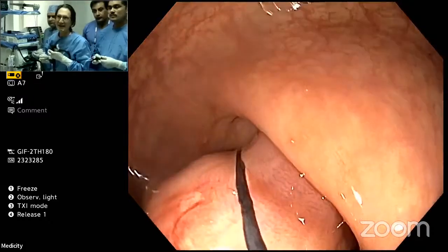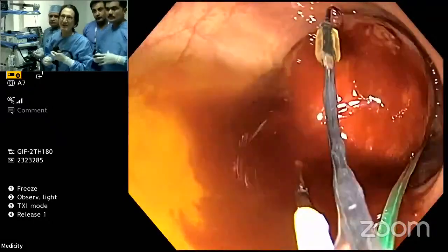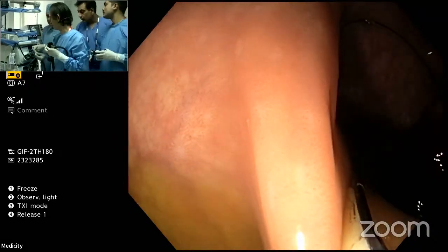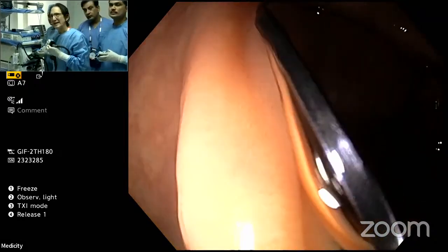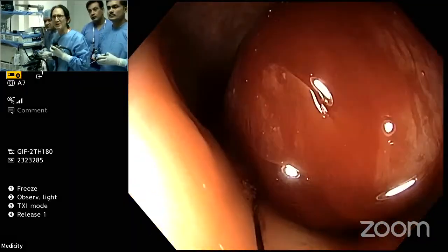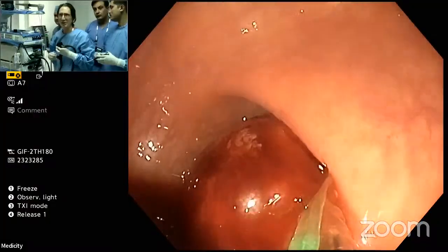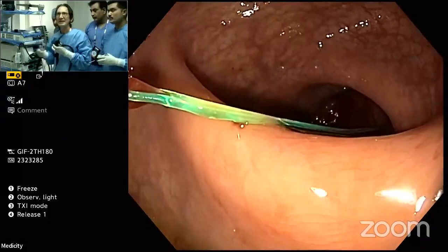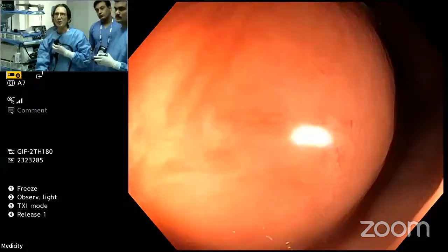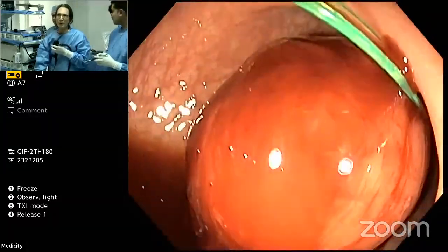It's a little bit more constrained, the space here. Okay, close now the snare, please. The other way, push this one forward, the snare. Yeah. So you have to realize the snare in a constrained space makes it a little bit more confusing, perhaps. Now the snare is out and the loop is out. I'm just going to push this all the way. All right. So now look at this. It's already started to turn violaceous. And I'm going to put a second loop below the first loop.